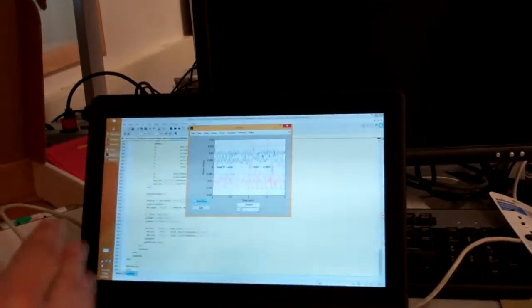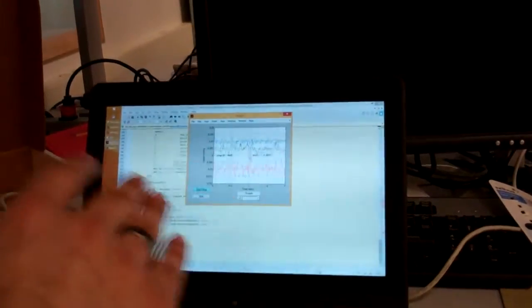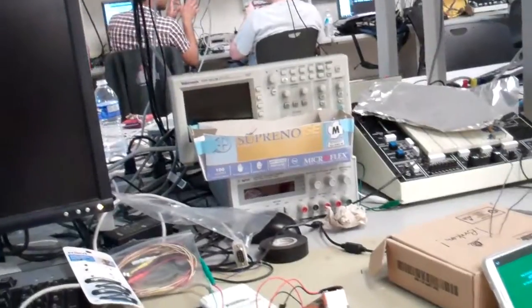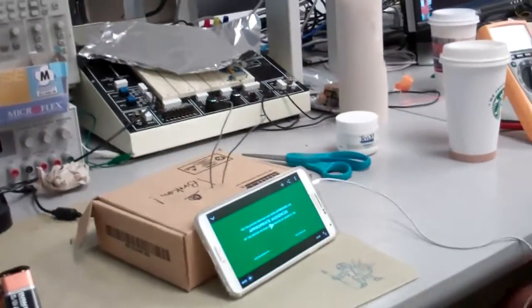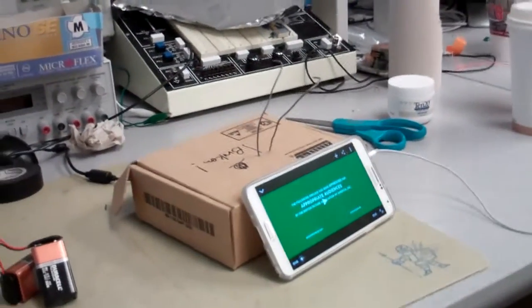And then we're going to, hopefully, with our experiment, observe how it changes when he's watching the video and when he's just relaxing. Okay. Sure. Yeah, let's do it here.